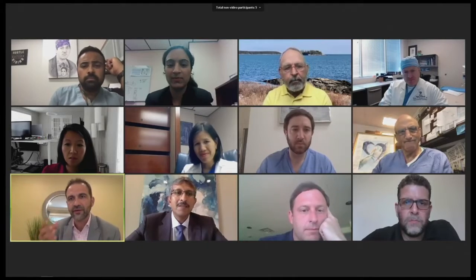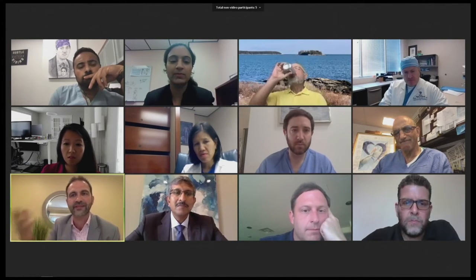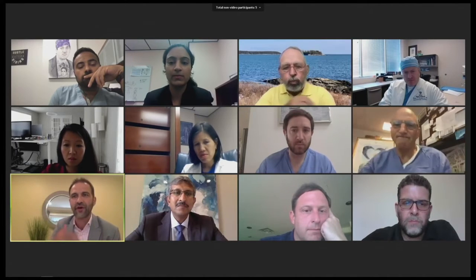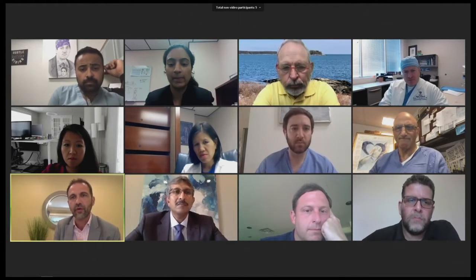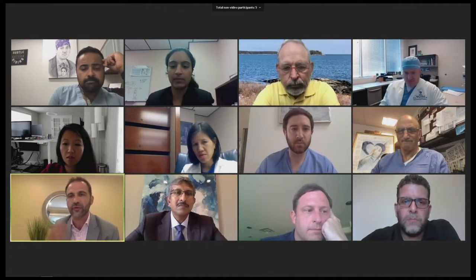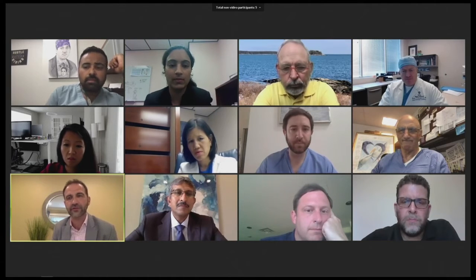Thanks. Dr. Sai, we have so many equipments now in our armamentarium. Classically, when we had a patient with acute limb ischemia, we put a catheter, we lysed the patient. Now we have Penumbra, we have AngioJet, we have other technologies available to us. How do you decide when you should lyse the patient, or when, in this case, like Dr. Lee performed, do AngioJet or Penumbra or a suction catheter or other form of therapy? And when do you combine the two?